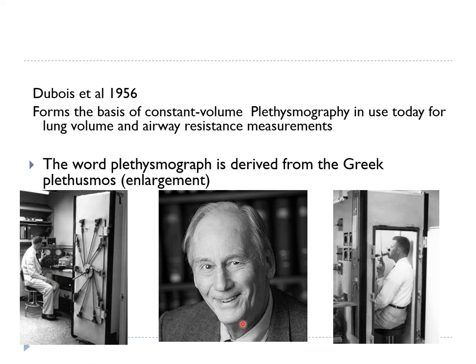So this is Du Bois et al. In 1956, he devised the first body plethysmograph, which helped in the determination of the lung volumes and also the airway resistance measurement. The word plethysmograph is derived from the Greek word plethysmos, which means enlargement.